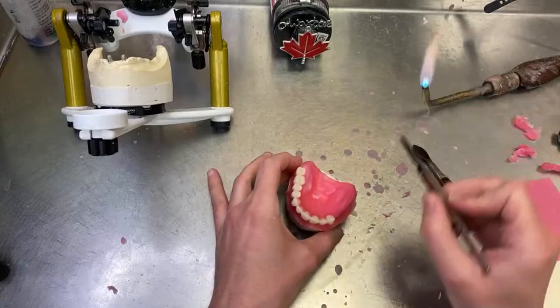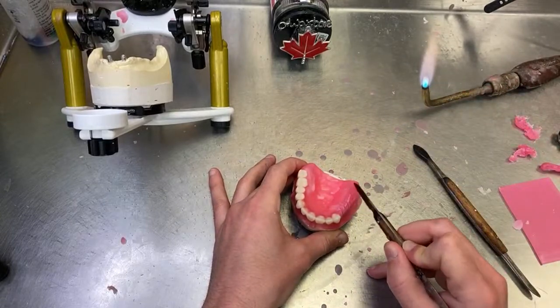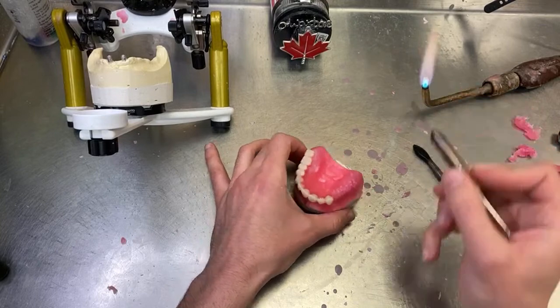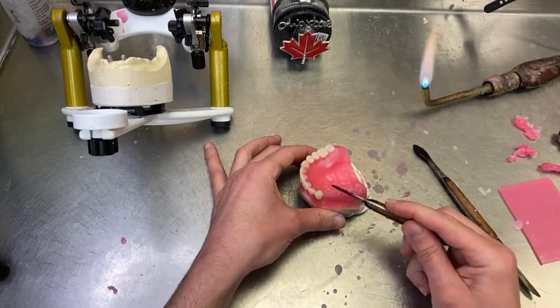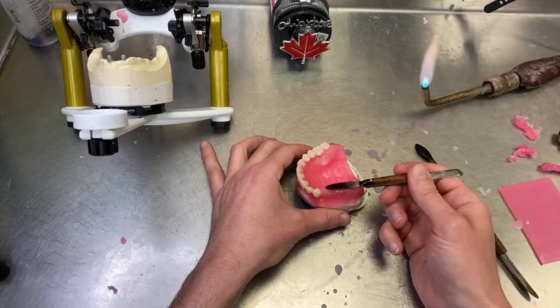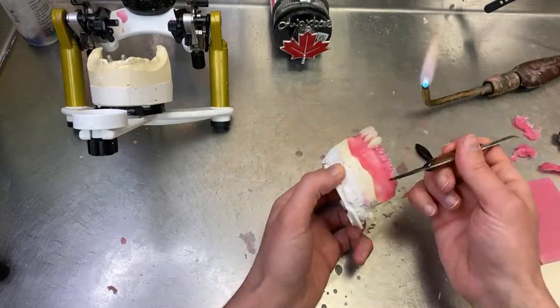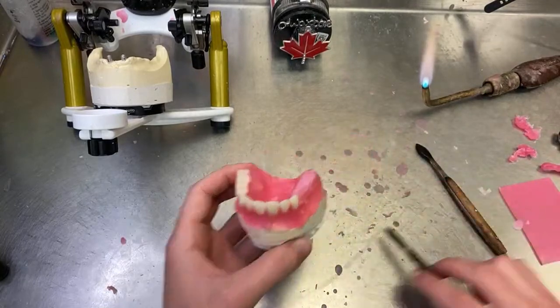Yes, we can use tables, and I do have a template and a setup plane that I can use on balanced occlusion cases, but we have different cases. This case is a regular one. Calibrated cases, we charge differently for those ones. And we take everything differently, like the impressions and the transfer of the bite. This one here is just a try-in.